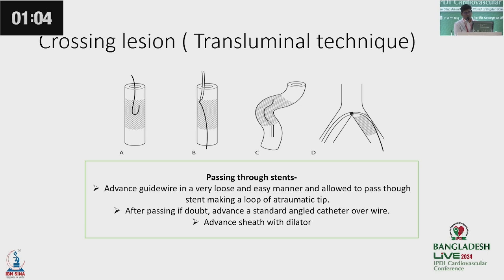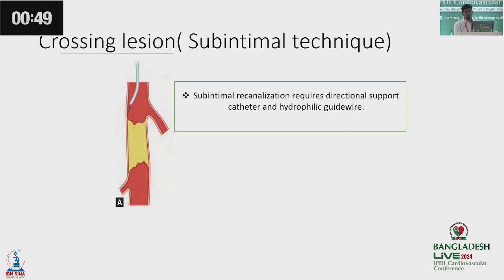This picture shows an in-stent re-stenosis case, which we often face. In this case, you pass a wire very gently. If you want to ensure that you are within the stent or not, you pass a catheter, give dye, see the position, then do your procedure.